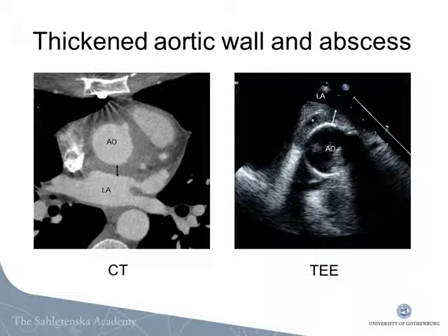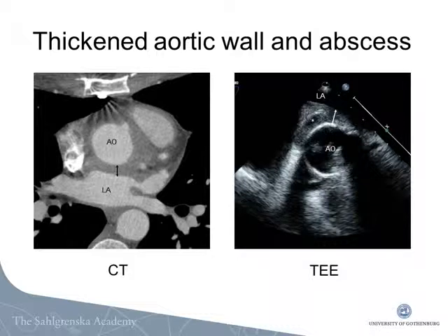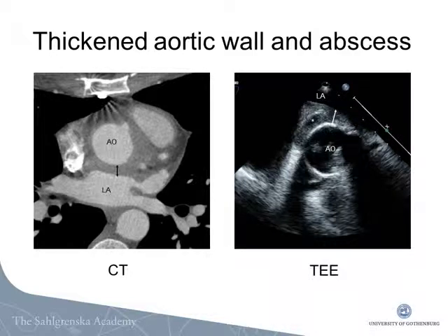This shows the abscess that was detected only with TEE. The TEE image to the right shows a small abscess cavity in the aortic wall marked with an asterisk. The CT image to the left shows a thickened aortic wall indicating infection, but the abscess cavity could not be detected.